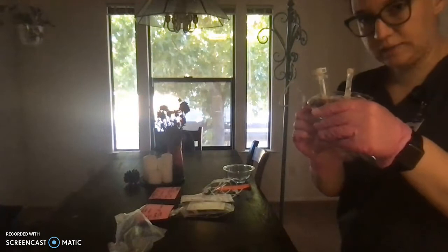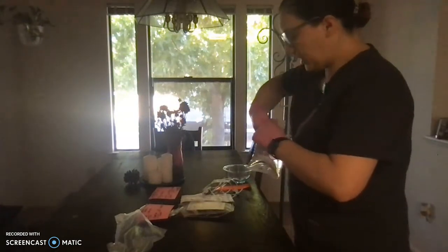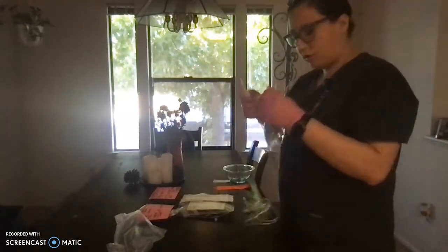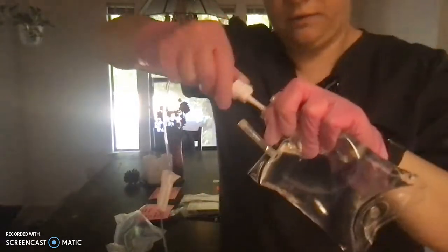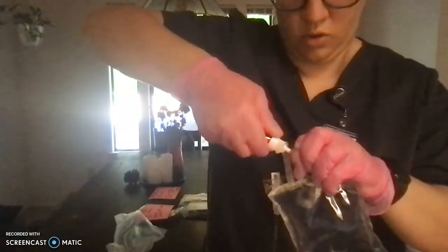So I'm going to spike this primary bag. And of course, we want to make sure that our patient does not have any allergies towards this medication. Going to keep sterile the site, and we're going to spike that tubing in a twisting fashion.